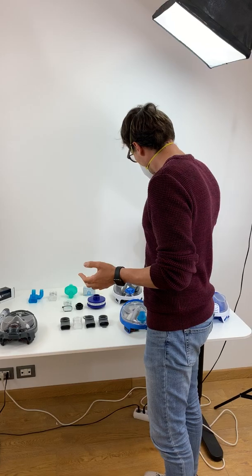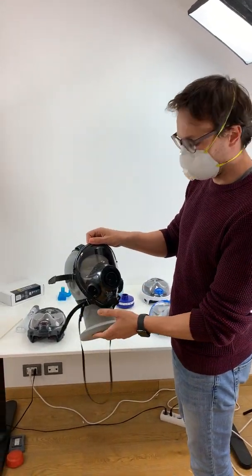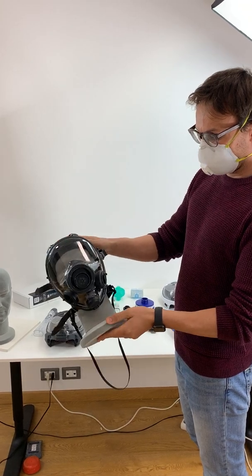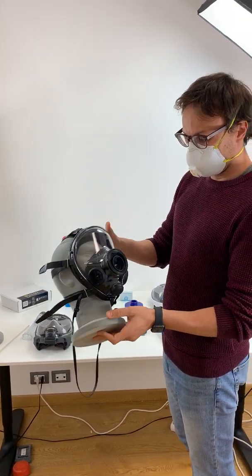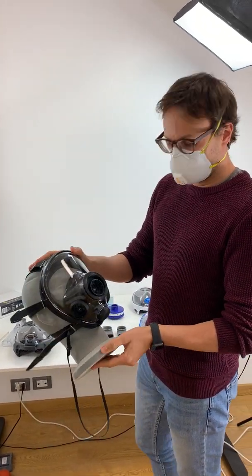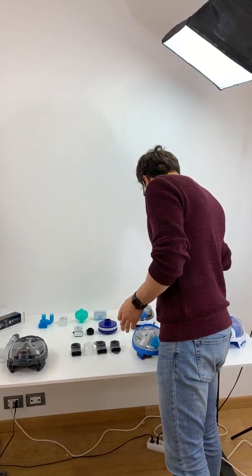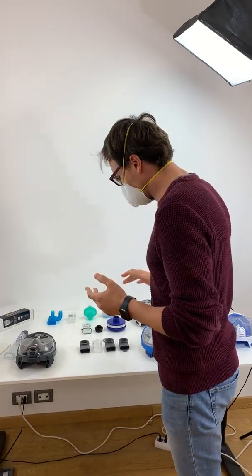We have a background of more than 30 years in personal protection equipment and gas masks. This is a safety protection equipment gas mask — a 400/3 — and we've been doing this since quite a while, so we kind of know what we're doing.